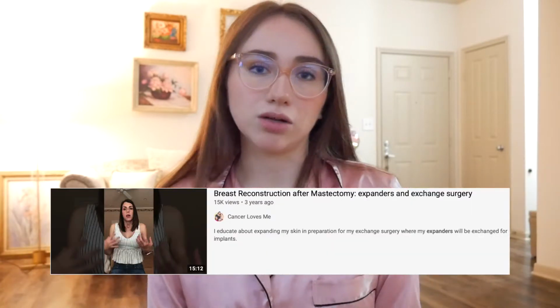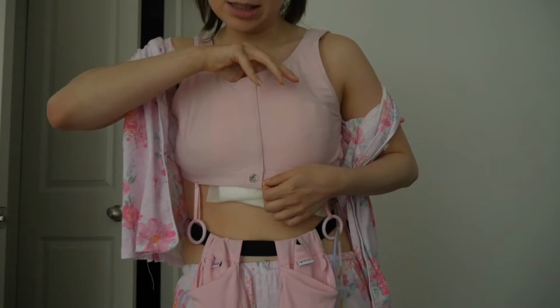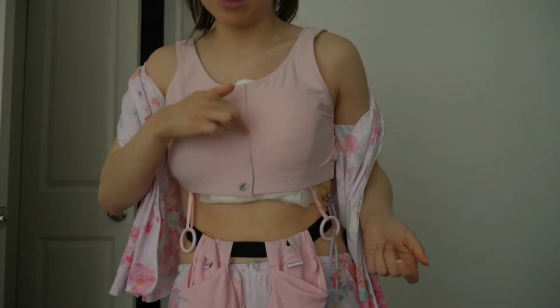If you guys haven't seen a lot of the videos on YouTube, I mean, I feel like there isn't really that many, honestly, but that's typically where I go when I'm looking for a similar experience, just because I don't personally know someone that's had a mastectomy, especially none of my friends at 24 or anywhere in my age group. I had a single mastectomy, so I just have one expander on one side. When you do wake up, you do have something there. It's not completely flat, which is actually good.